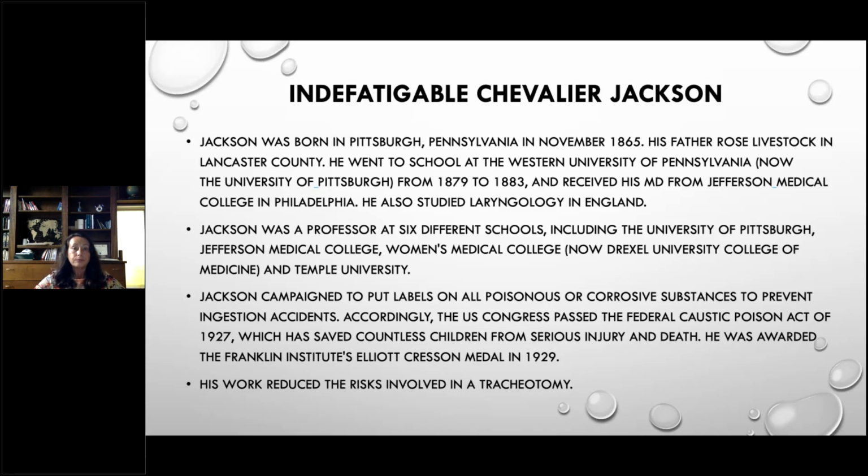His work helped reduce risks involved with tracheostomy, because with use of his tools, he was able to remove foreign bodies from the trachea that otherwise would have required a tracheostomy or maybe even caused death of those children. And later on, I'm going to show you the remarkable examples of the foreign bodies that he removed.